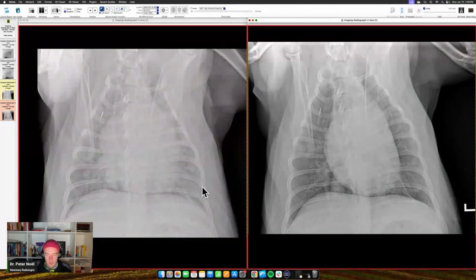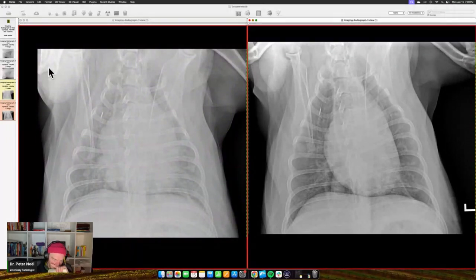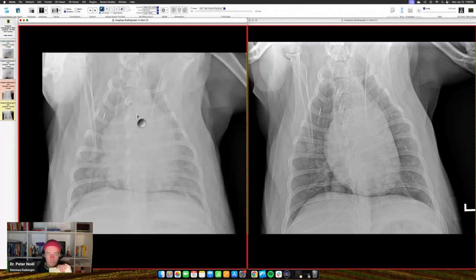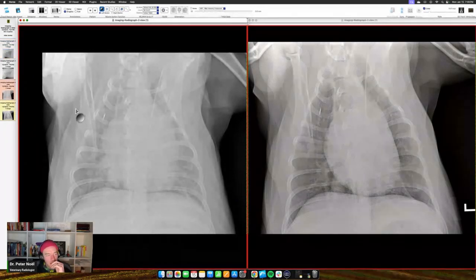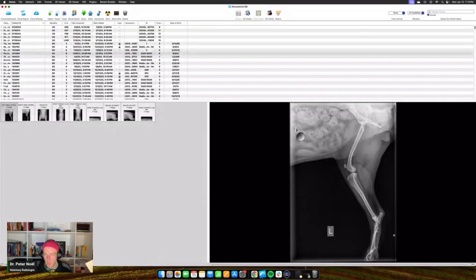That's probably a nipple. Okay. And then you kind of look back here and there's nothing. So the whole thing is you got to be aware that there are limitations of the study. The differential attenuation is critical. This is a great example of you just took a little bit better breath on the right, pulled in a little more gas, lung a little more radiolucent. Oh, great example.